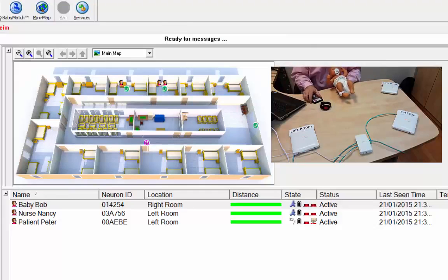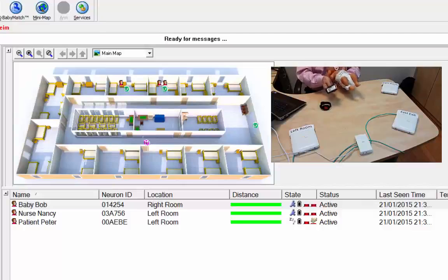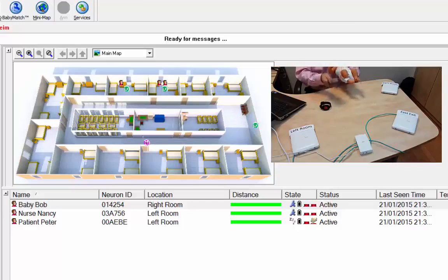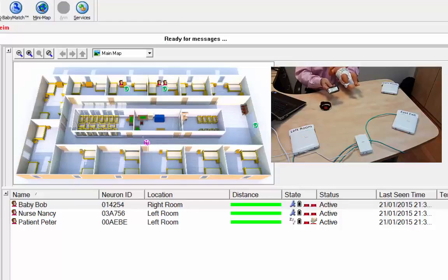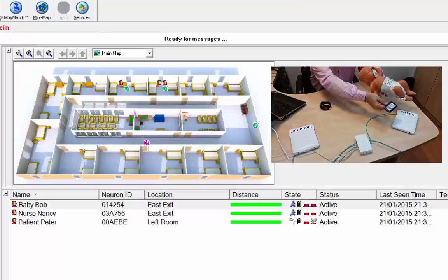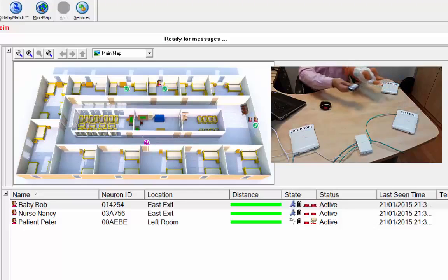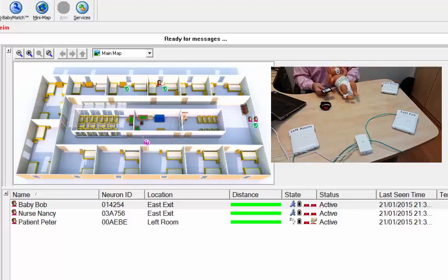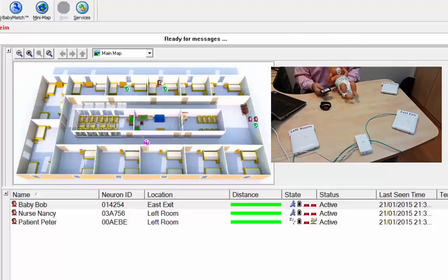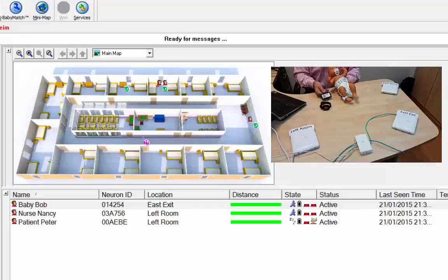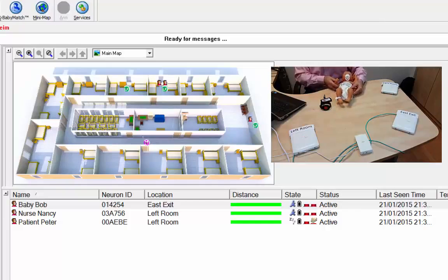Now, I'm going to take the staff and the infant together into the exit. So, now, they both go into the exit, and there's no alarm. So, that's how we do escort.